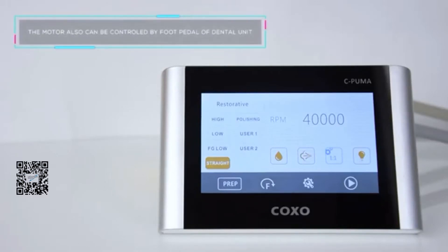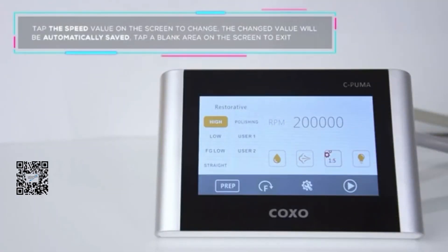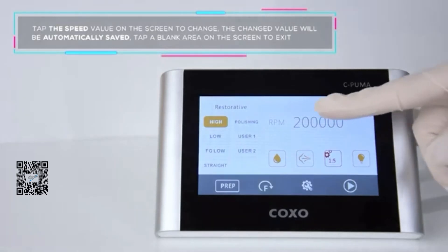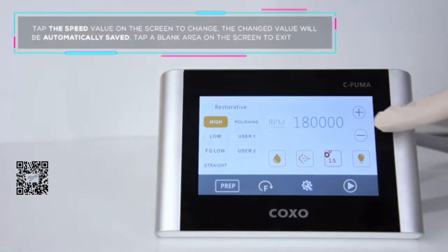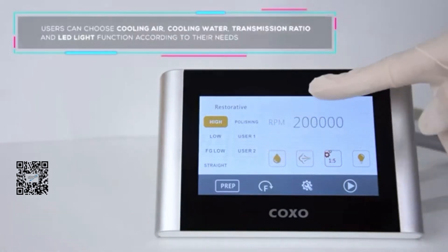The motor can also be controlled by the foot pedal of the dental unit. Tap the speed value on the screen to change it. The changed value will be automatically saved. Tap a blank area on the screen to exit.